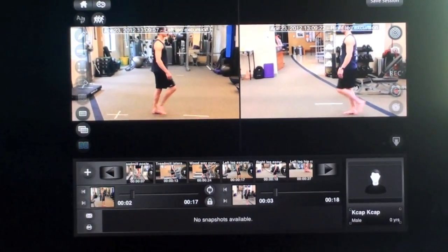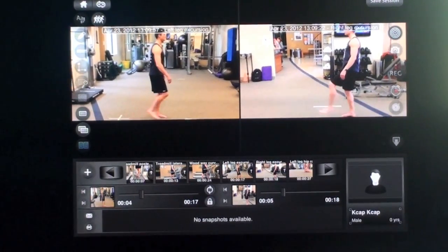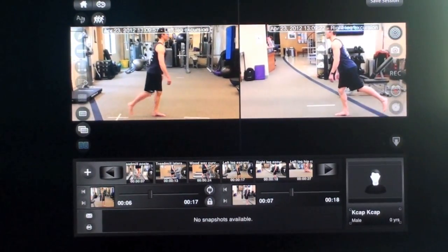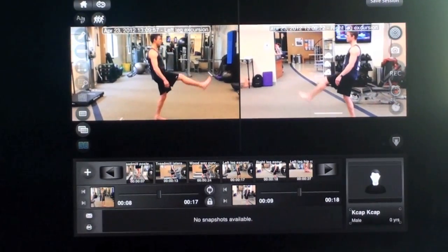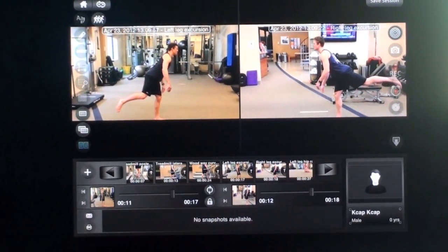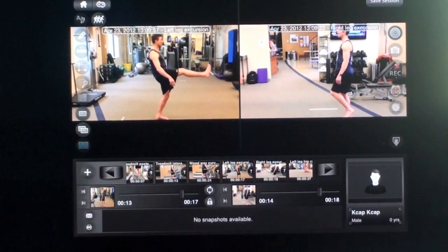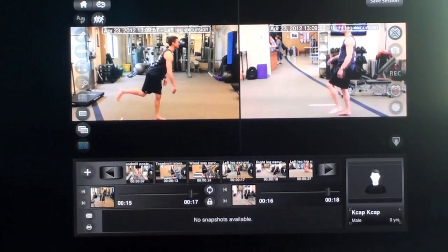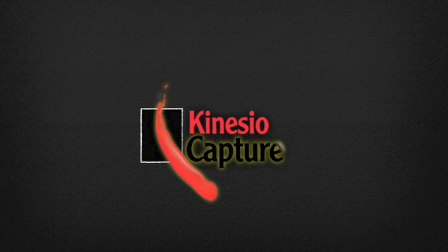And then a side-by-side comparison. It's a very powerful tool to show an athlete recovering from an injury the differences between the two sides of the body and how they may be compensating. Thank you.